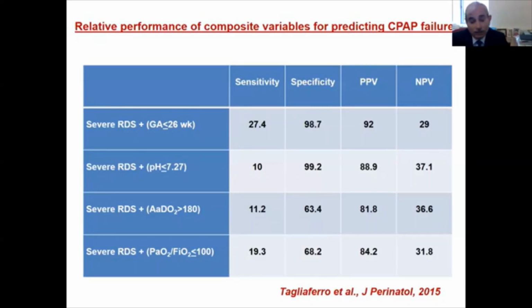It's whether you know the pressures you're generating, and if you know, our incidence of BPD is 6 to 7%, and that's true as of 2018. You tell me anything which will bring my BPD rate to less than 5%, I will follow it blindly. Don't talk to me if your BPD rate is 60% and you are bringing it down to 55%. If you can help me bring my BPD rate below 7-8%, I would love to follow that therapy. Until then, I just want to continue what I do.